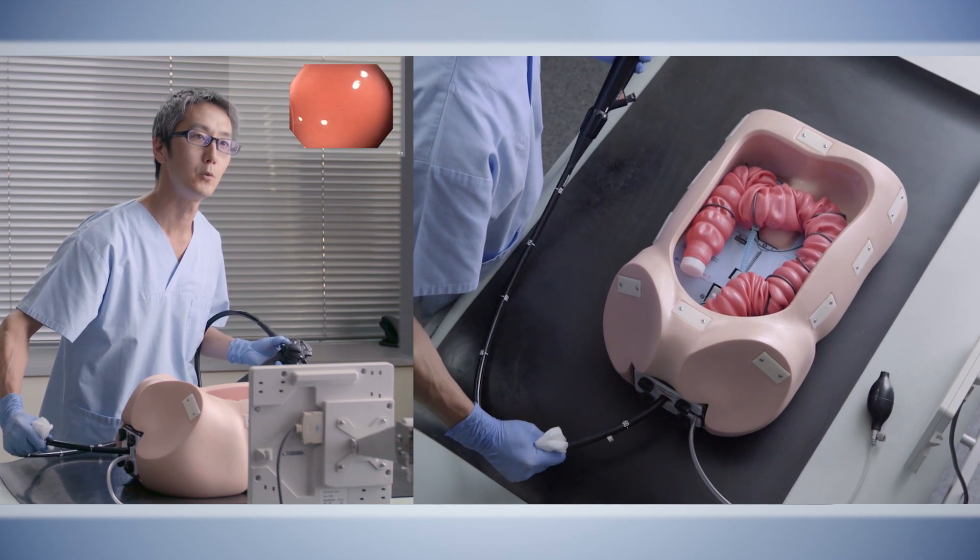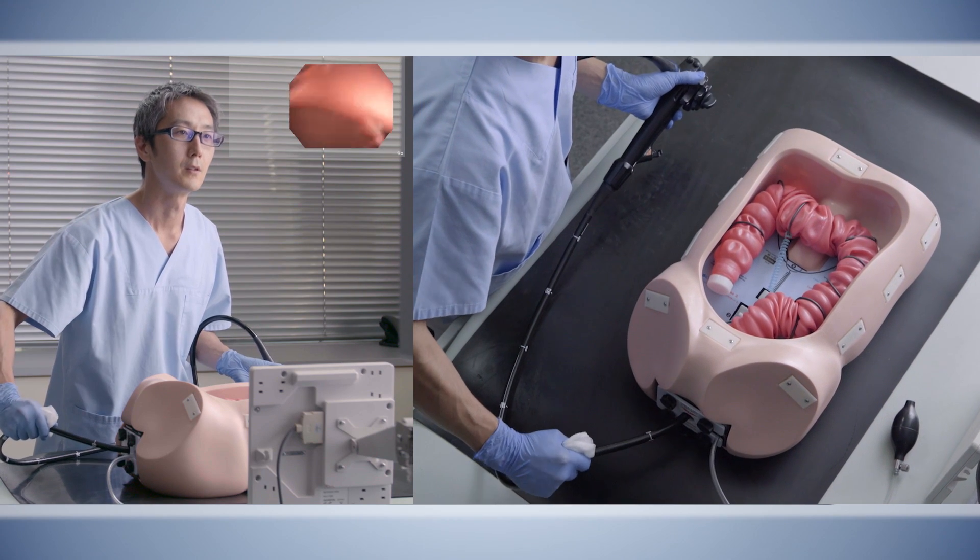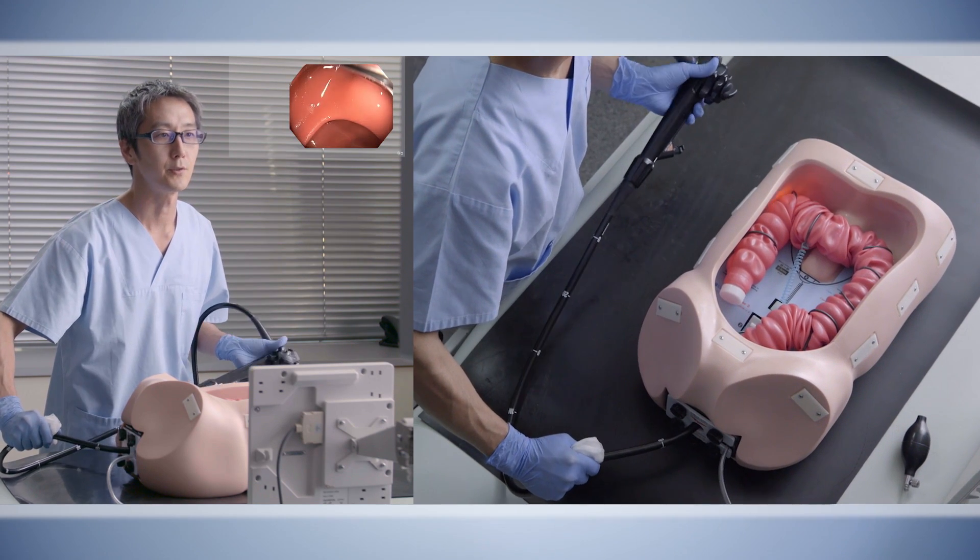This is a very slow movement. We can also use suction.